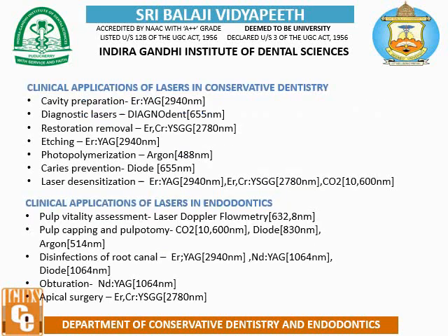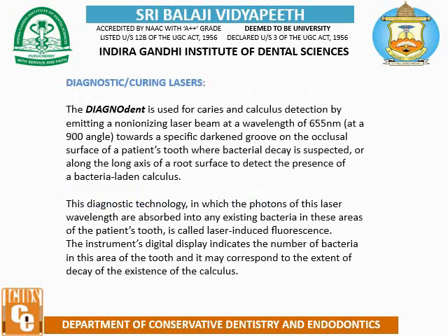Clinical applications of laser. Clinical applications of laser in conservative dentistry include cavity preparation, diagnostic lasers, restoration removal, etching, photopolymerization, caries prevention, laser desensitization. Clinical applications of laser in endodontics include pulp vitality assessment, pulp capping and pulpotomy, disinfection of root canal, obturation and apical surgery.